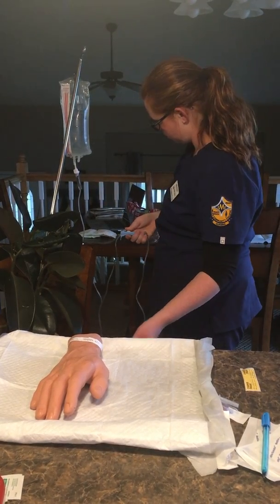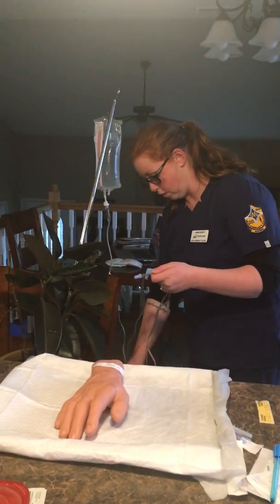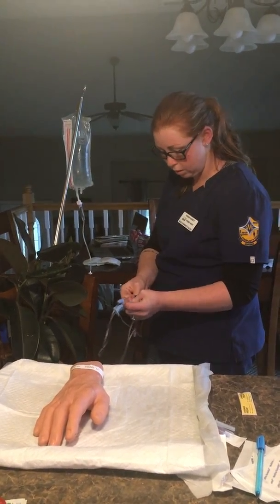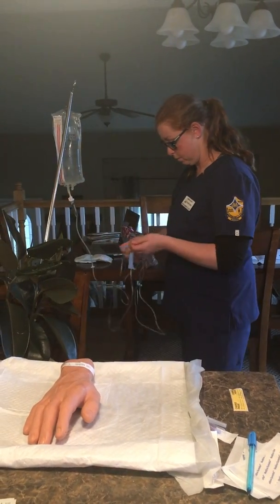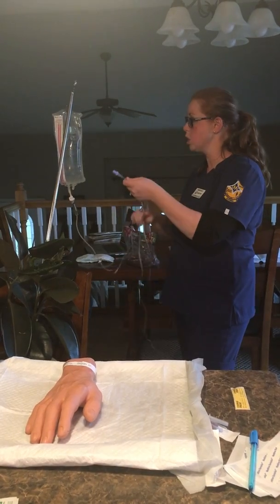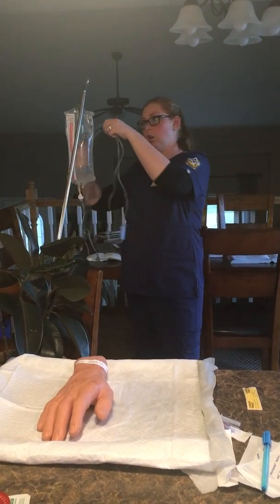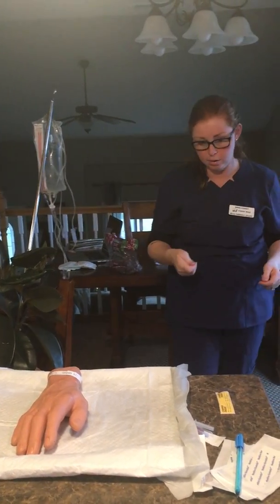And stop. Perfect. We are right on. Okay. So then after we do that, we can just clamp this off so that we have that all ready to go and we get the patient's catheter in, and then we can just get it started. Okay. So making sure to maintain sterility on the end. I'm going to make sure that doesn't touch the ground. Make sure we've got the cap on and everything. It's all set and ready to go.